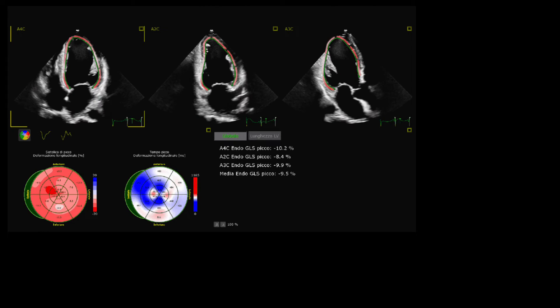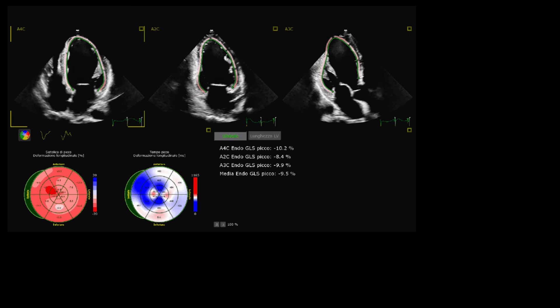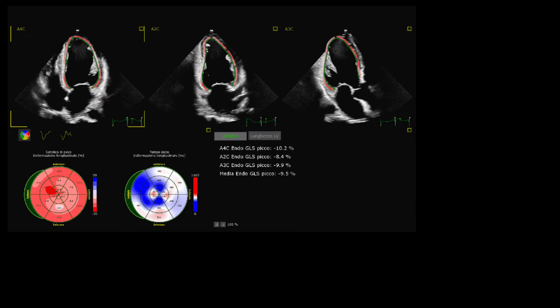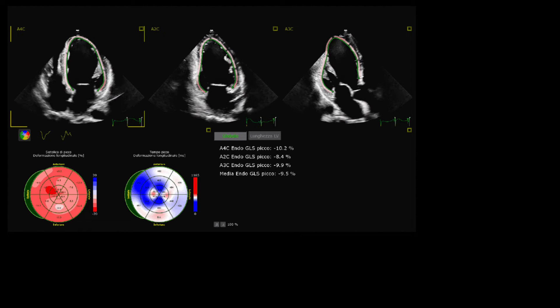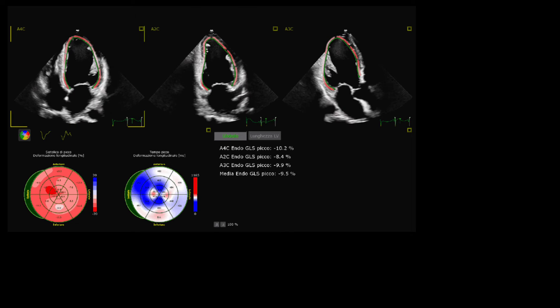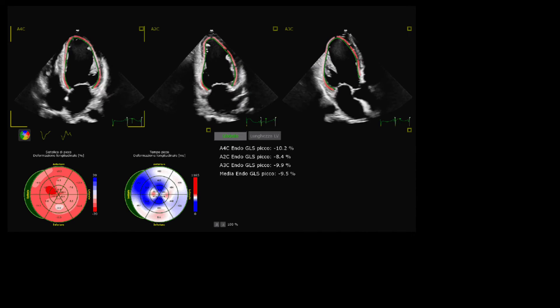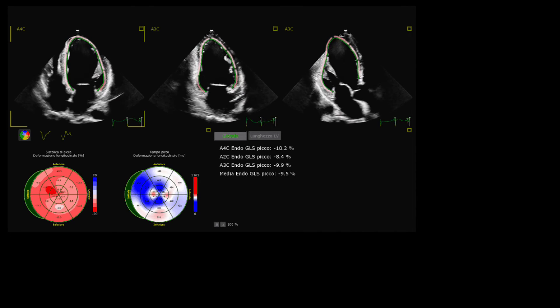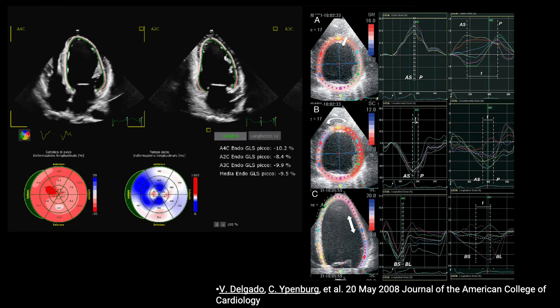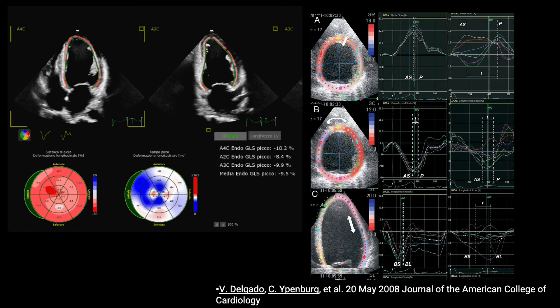Strain analysis allows discrimination between active and passive movement of myocardial segments and permits separate assessment of distinct components of myocardial deformation: longitudinal and circumferential shortening, radial thickening, rotation, and twisting.